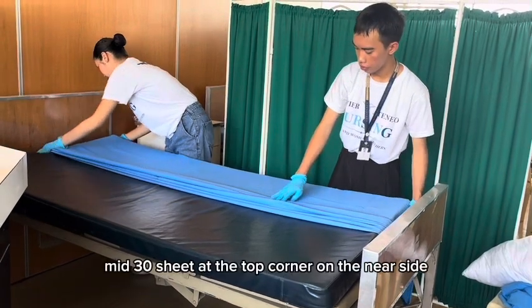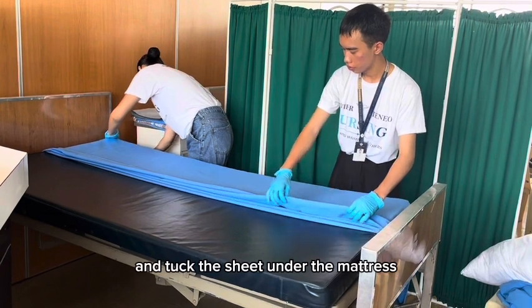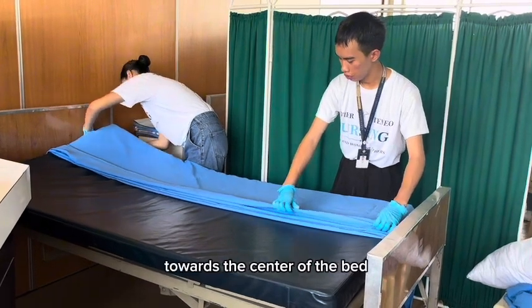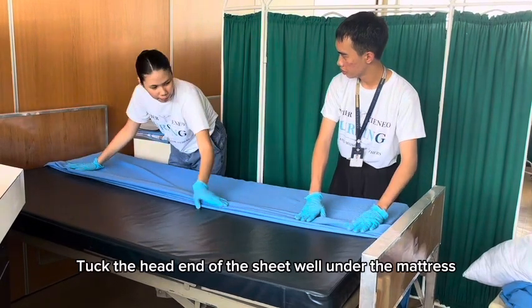Miter the sheet at the top corner on the near side and tuck the sheet under the mattress, working from the head of the bed to the foot section. Fan fold half of the sheet towards the center of the bed. Tuck the head end of the sheet well under the mattress.